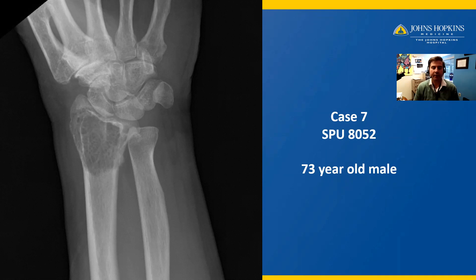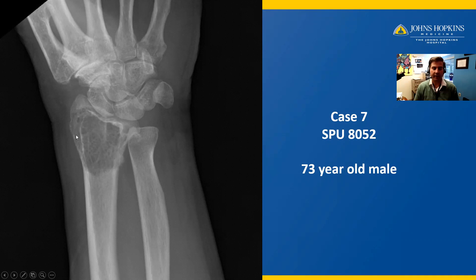Case number seven is from a 73-year-old male. Here we have a lytic and expansile mass in the distal radius extending to the articular surface and is centered in the epiphysis of this long bone. The mass has a well-defined but non-sclerotic and narrow zone of transition proximally. The mass remodels and expands the cortex but does not destroy the cortex.